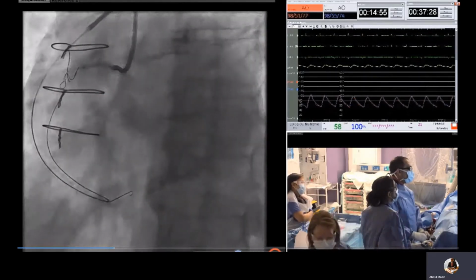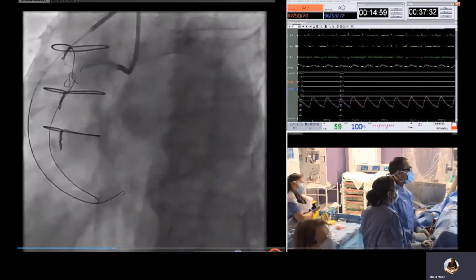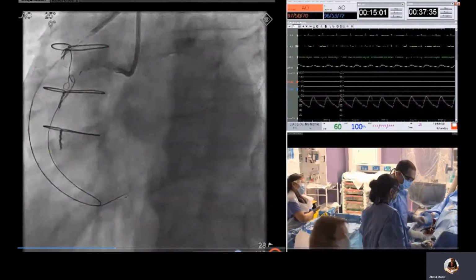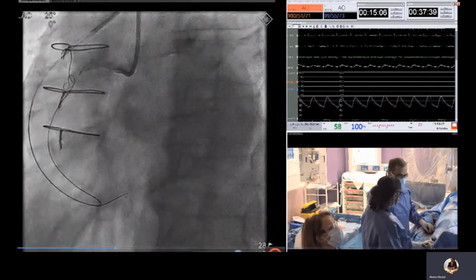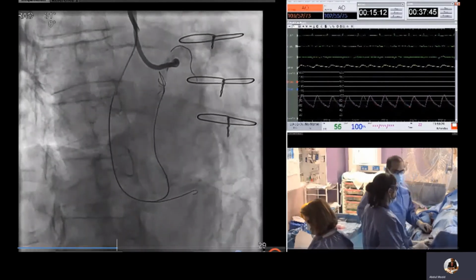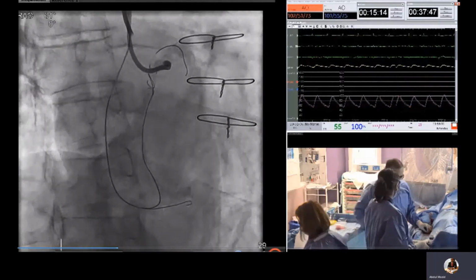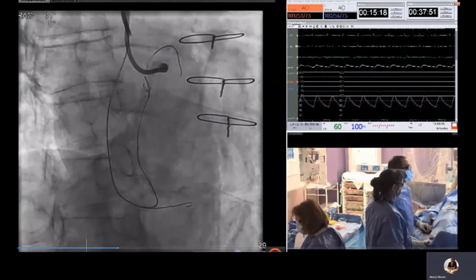And then with the balloon inflated, this then provides a coaxial anchoring balloon, also known as power knuckle. And with that inflated, this gives a very stable platform to perform antegrade knuckling. And we check in two different views. And here in RAO, you can see that the antegrade wires overlap with the retrograde equipment.